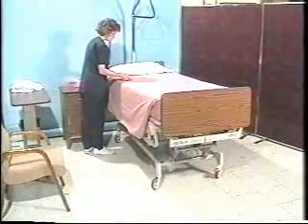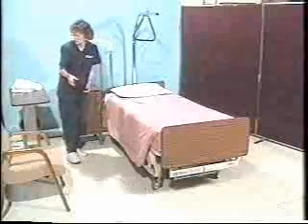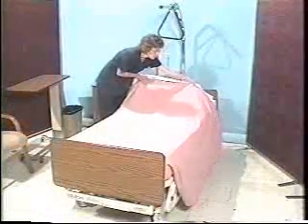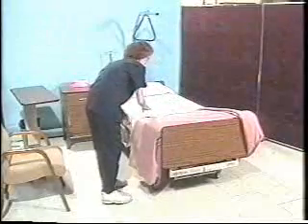To finish the procedure, the caregiver attaches the call light, lowers the bed to its lowest position, and places personal care linens in the bedside stand. To open the bed, the caregiver grasps the linens, walks past the foot of the bed, and fan folds the top linen in thirds. When the patient gets into bed, the top linen can be pulled up easily.